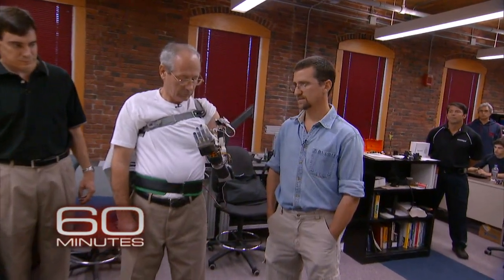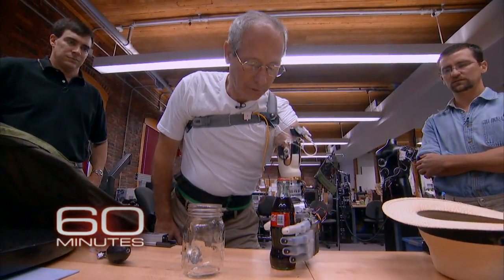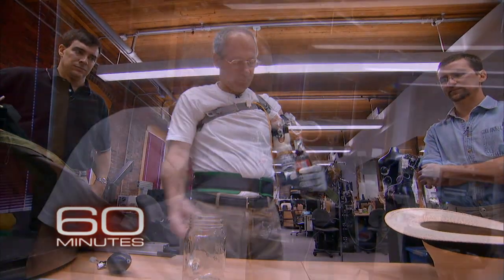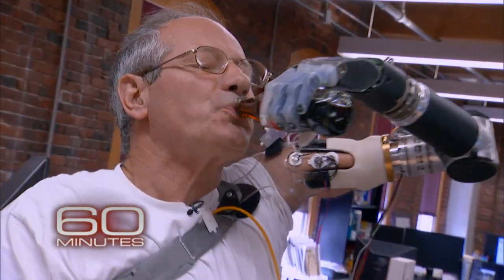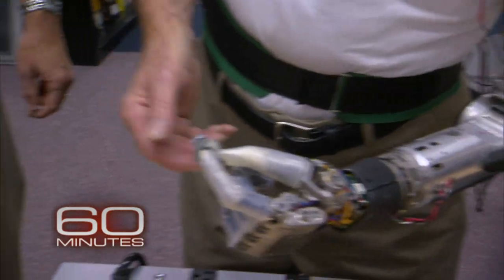After practicing for 10 hours, Downs showed us what he could do. Now I use my toes to grasp this. The feeling is hard to describe. For the first time in 40 years, my left hand did this. I almost choked up saying it now, it was such an amazing feeling. I was 23 years old the last time I did that. It felt so good to move my arm again, to do things with it.